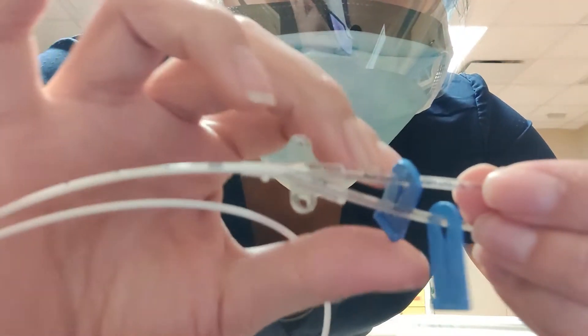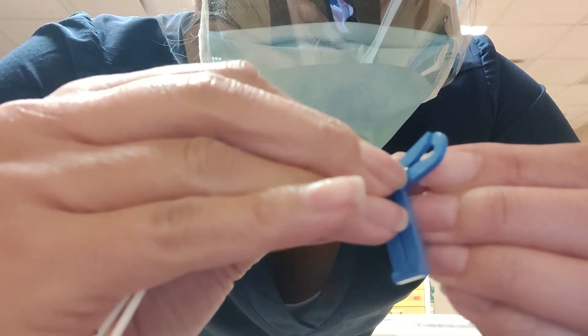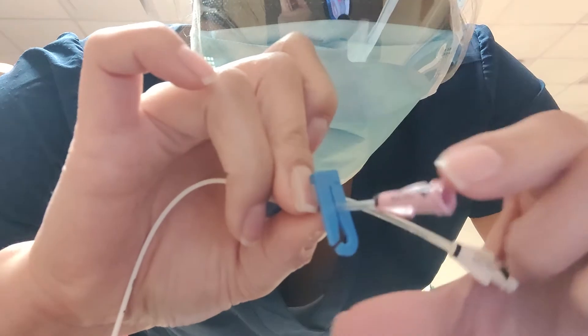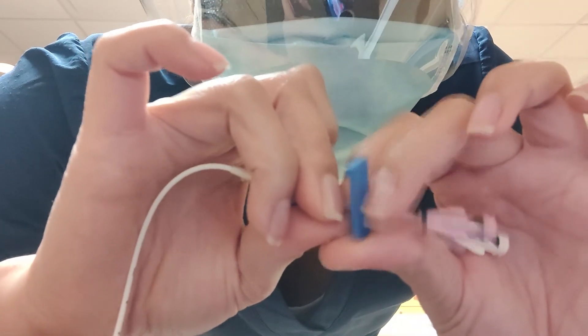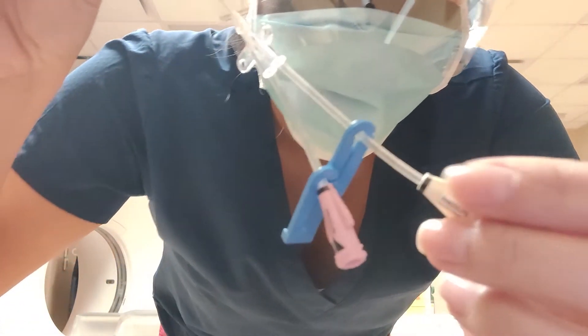This little thing right here is to squeeze the line so that nothing has backflow that comes back out — it's kind of like a clamp. See that? You can't inject and nothing can come out. And if you need to open it back up, you just push it down.